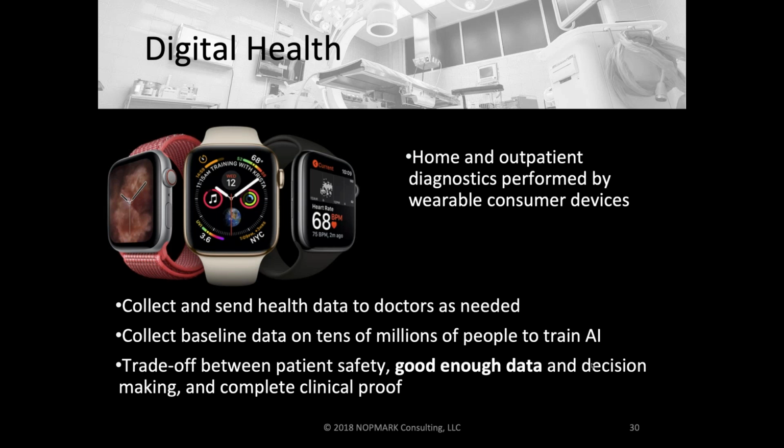So they collected a lot of that data from that testing perspective, and that was the basis of the submission. But the other interesting aspect of this digital health is the device, right? The medical device, because the app is on there. It's not a device in a doctor's office. It's not a device in a hospital. The device is on you. It's your purchased device that's on you running this medical device software that's collecting the data.